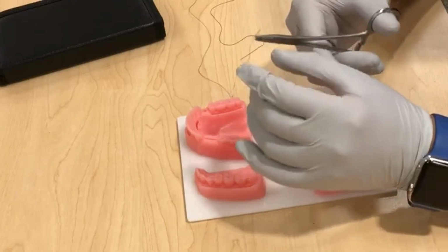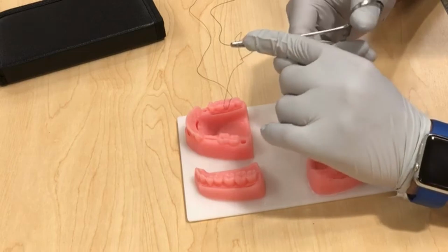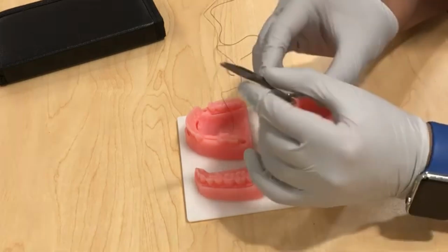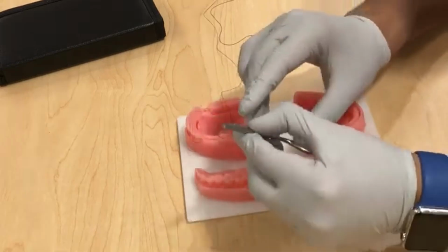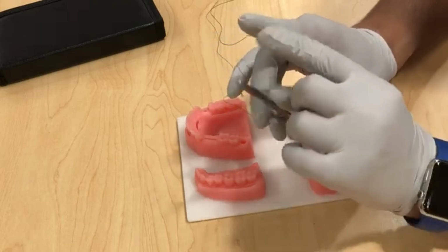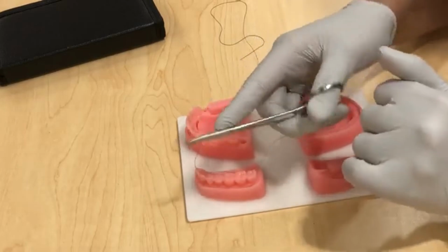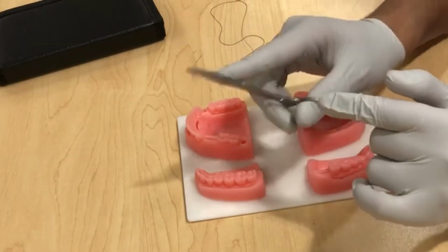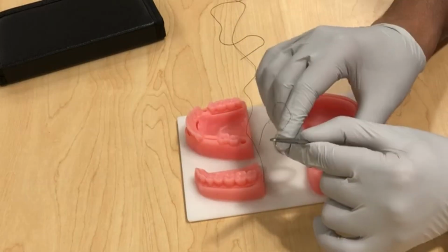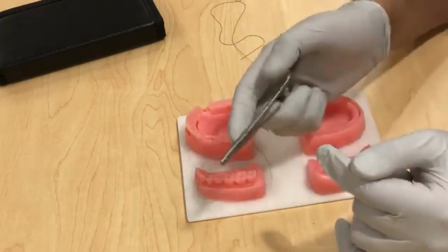So the best way to hold the needle is 2/3 the way from the tip. So not at the end and not at the tip. The correct way to hold the needle holder is your thumb in one ring and your ring finger in the other ring, not your index and not your middle finger. Your index should go straight to help maneuver and direct your needle. The middle finger should help secure the grasp. Also, another technique you could do is by palming the needle holder like that. It gives you more freedom of rotation and movement.